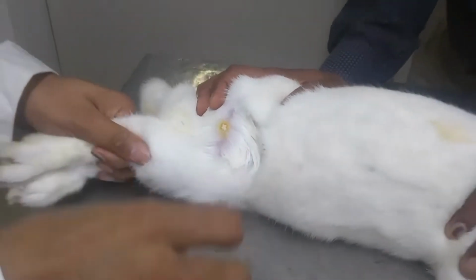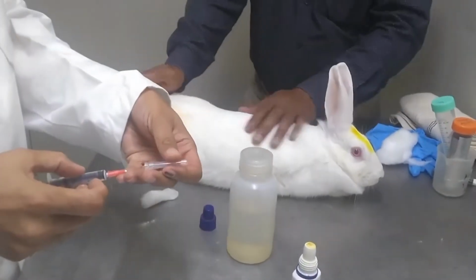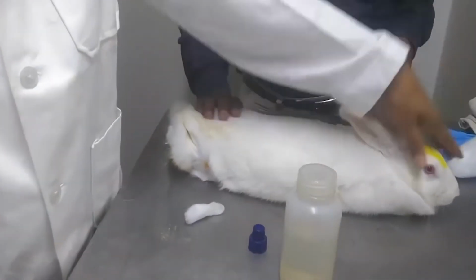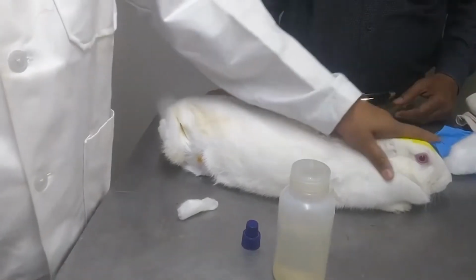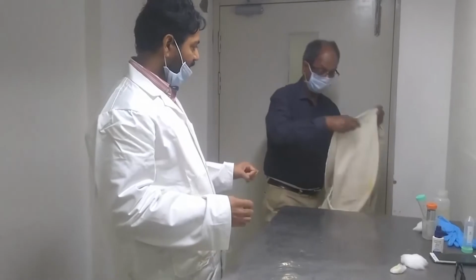And then slowly release, leave the animal relaxed, and it is immunized.